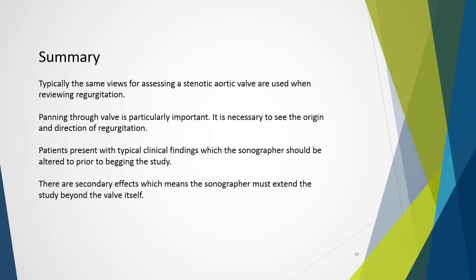The patient presents with typical clinical findings, which the sonographer should be able to identify, and then using that information, alter what would be the normal standard scan and apply advanced scanning techniques to assess for aortic regurgitation. There are secondary effects that we see with aortic regurgitation, which means the sonographer must extend the scan, as we just mentioned, so the study is more than just the valve itself.